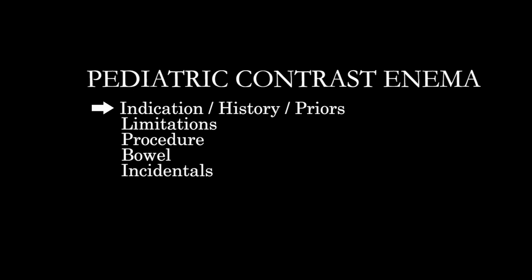All right, so big picture. How are we going to look at this exam? So the overall structure is, as with all studies, you want to get a sense as to what's going on with the patient. What is the birth history? What are maternal comorbidities that may increase your suspicion for any of these entities? Look at the current age of the patient, the gestational age. Look at prior imaging to get a sense of the bowel anatomy, any support devices and things like this.